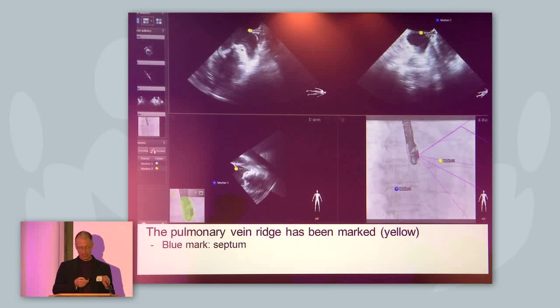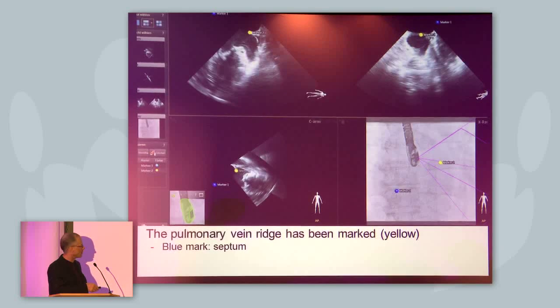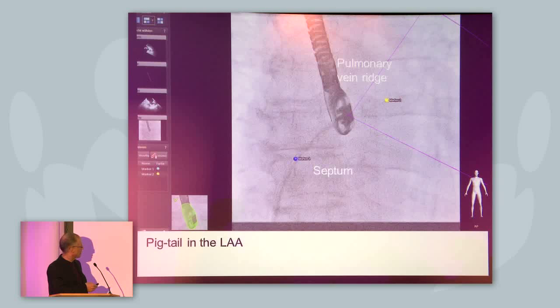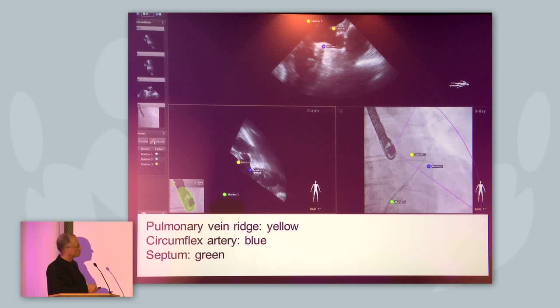When you look at the left atrial appendage, here is a yellow mark placed at the pulmonary ridge. You can see this yellow mark on fluoro, and you know that with your pigtail catheter or whatever catheter you want to use to engage the appendage, you have to be below this yellow mark. So here the pigtail is now in the left atrial appendage below the yellow mark, because that's the pulmonary vein ridge. This is the mark for the pulmonary vein ridge, this is the mark for the circumflex artery, and the pigtail catheter is in between — so you can confirm on screen before giving contrast that you are in the left atrial appendage.